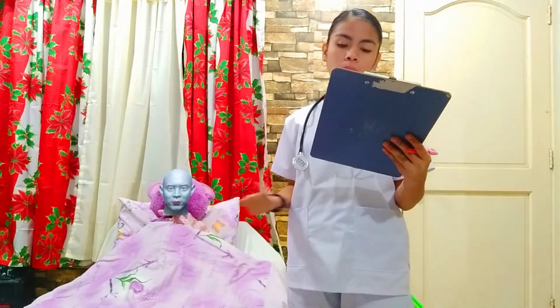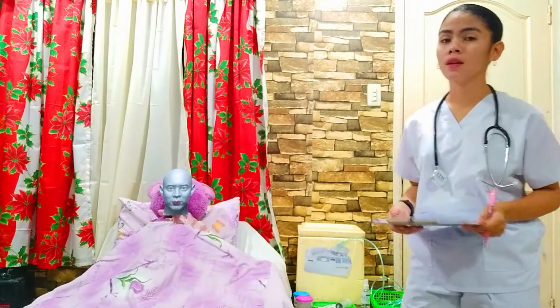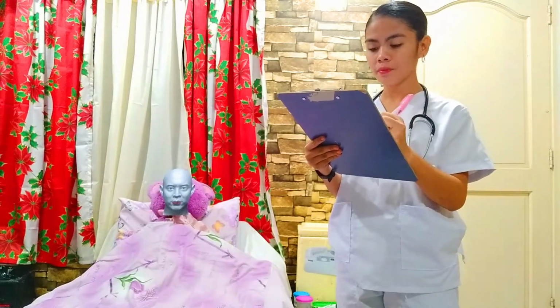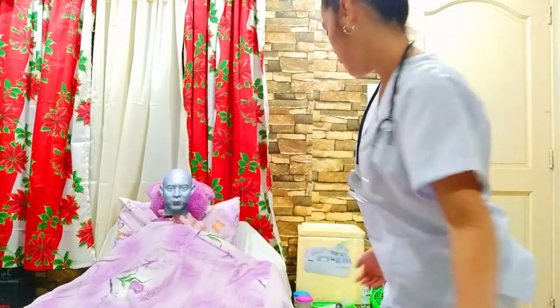The next is we need to ensure the client's privacy. As you can see, the curtains and the doors were closed, and all the data that will be gathered in today's procedure will be kept confidential. The next is we need to adjust the bed to a comfortable working height and lower the side rail closest to me.